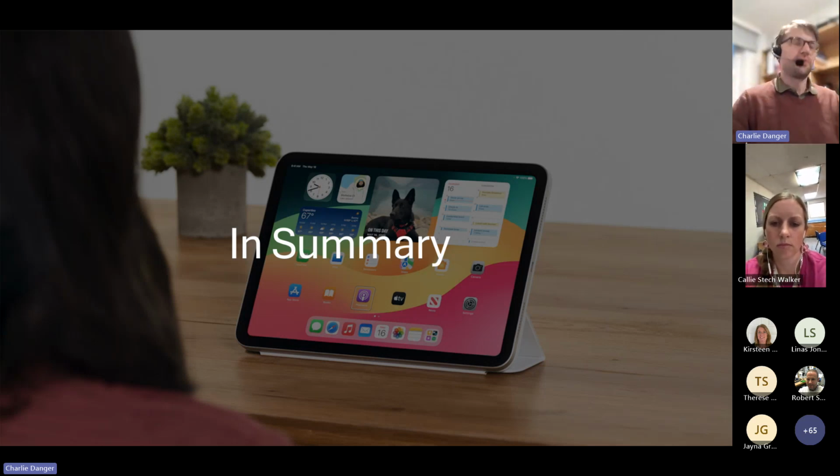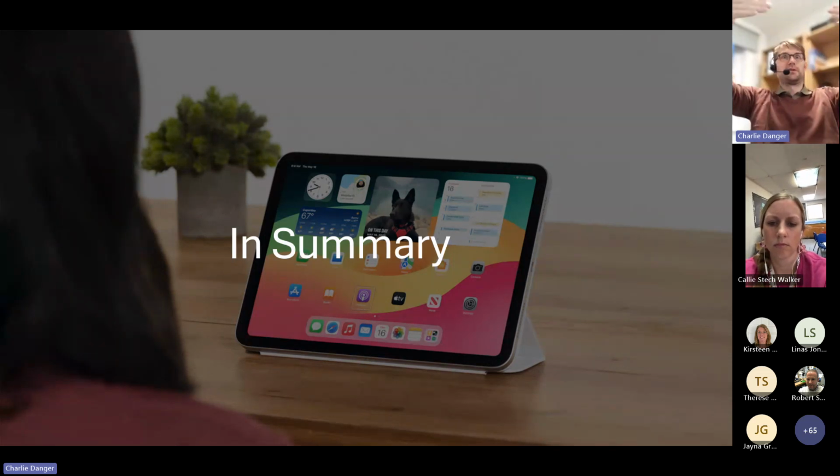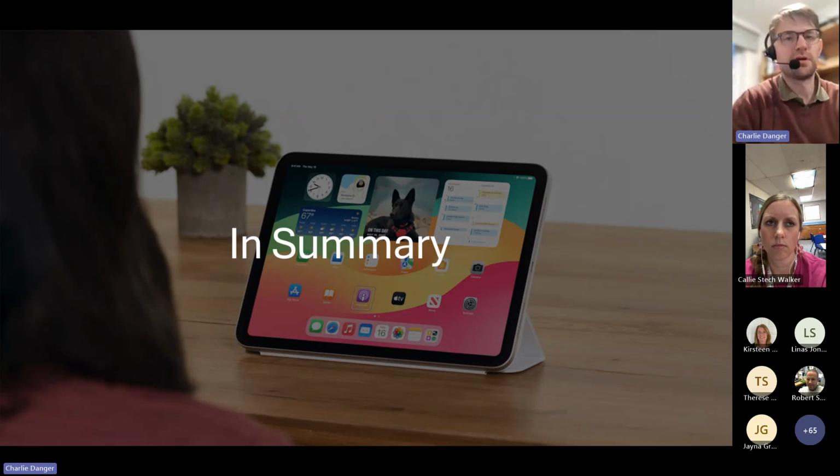However, as I use it, first of all, the iPad has to be up high, like level. I don't know if you can see a video of me, but up here so that my eyes are wide open, not low down so that my eyelids drop a little bit. That seems to be a thing.